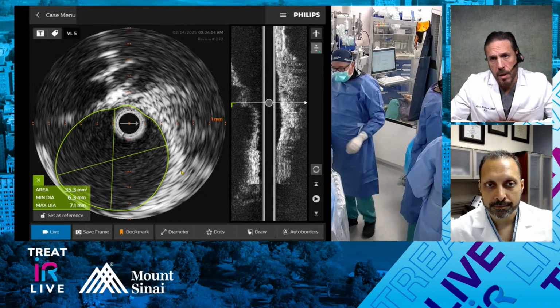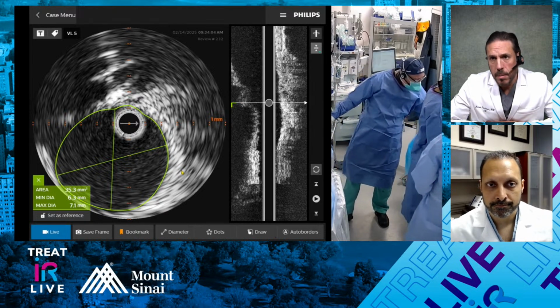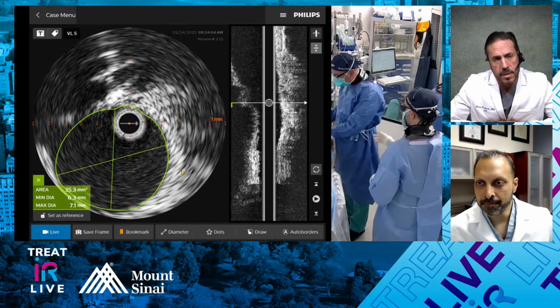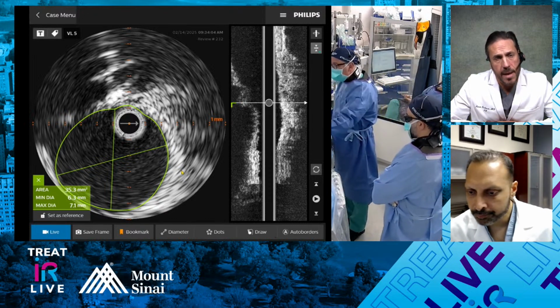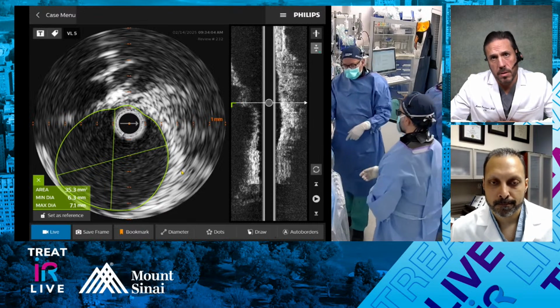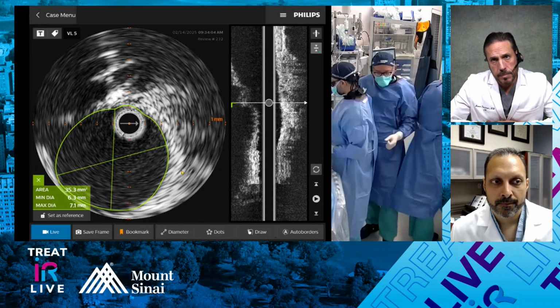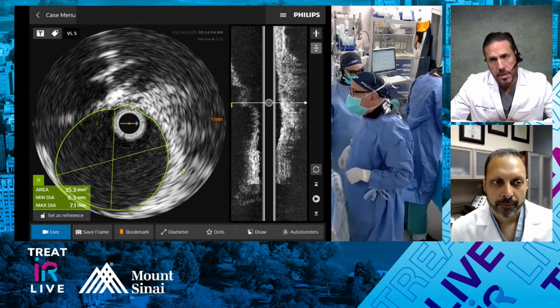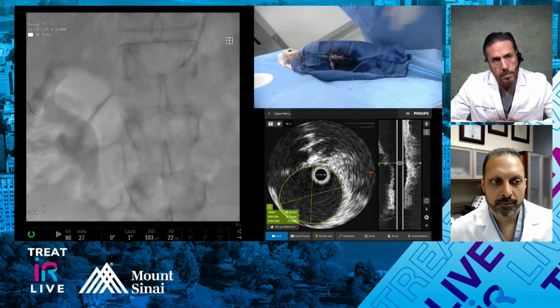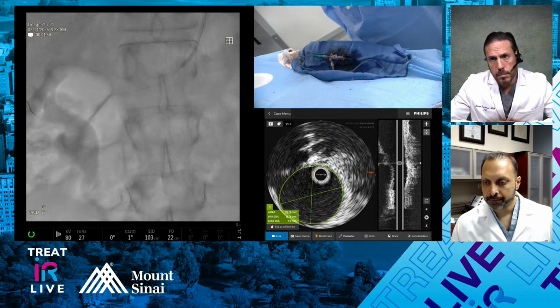I don't think we have the answer to that question, unless I missed it, Parag. In a case like this, the larger diameter is probably going to give you the most bang for your buck, despite the fact that you already used the DES in the other vessel. I don't think we have a lot of data for Takayasu's and renal intervention in general, right?